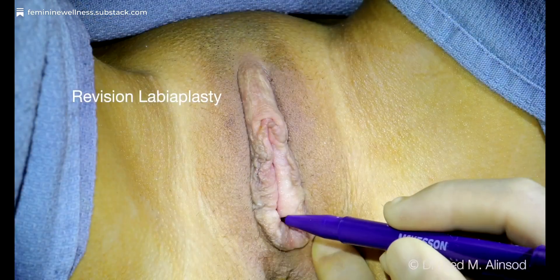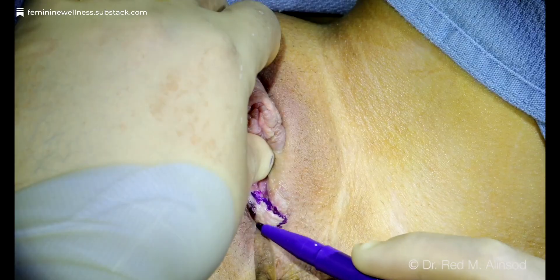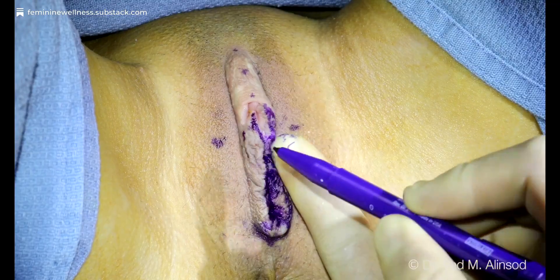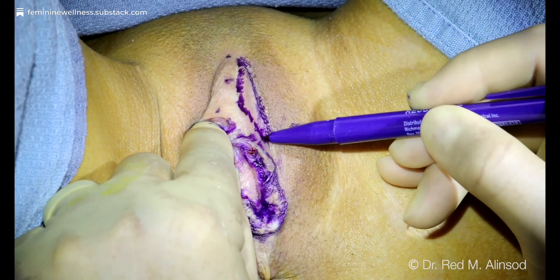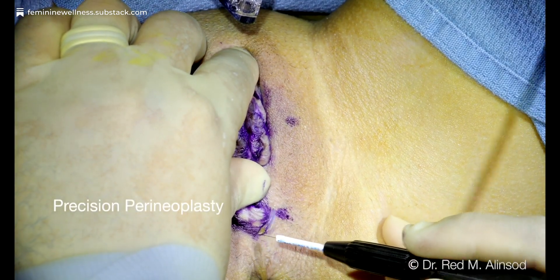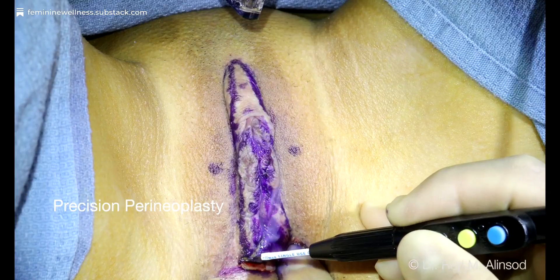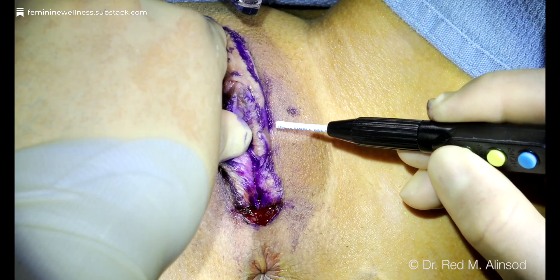I also use radiofrequency surgery for revision labiaplasty, and I believe this to be the finest device made for revision surgeries — to smooth out the edges, to refine tissues. Here you see me marking a prior labiaplasty that the patient does not like because the edges didn't heal as fine as she wanted. She had seen a plastic surgeon who did the labiaplasty and wants it revised. She also wants a hood reduction on both sides. You can see this can be used in the perineum, and you can have precision perineoplasties performed — lining up the edges quite well so the patient, when she heals up, will look like she never had a baby.